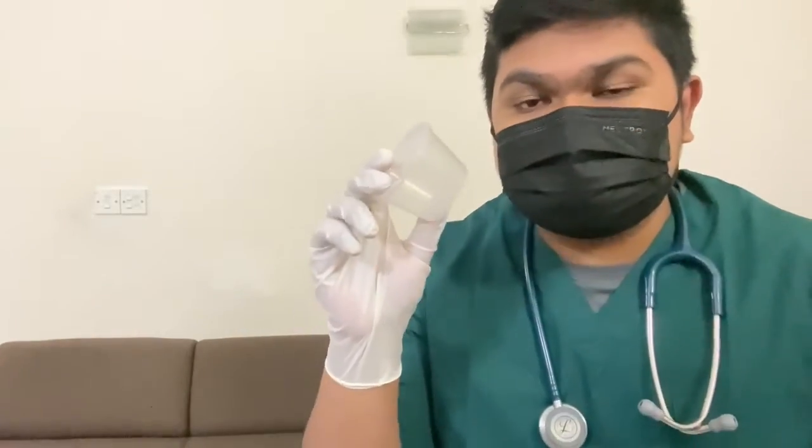Now, let's begin the demonstration with the first method, which is the normal method, just by using the urine container itself as well as with our patient. Today, our patient will be Idris Elba, the man who's supposedly going to be the next James Bond.